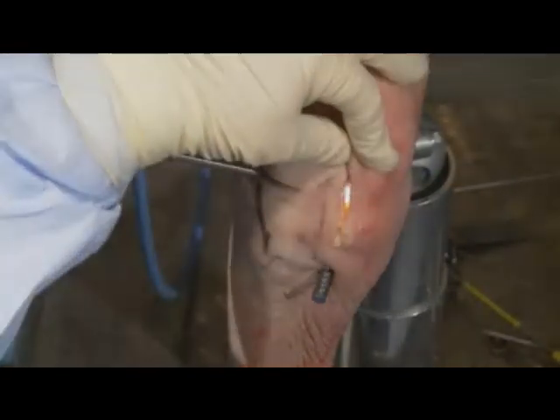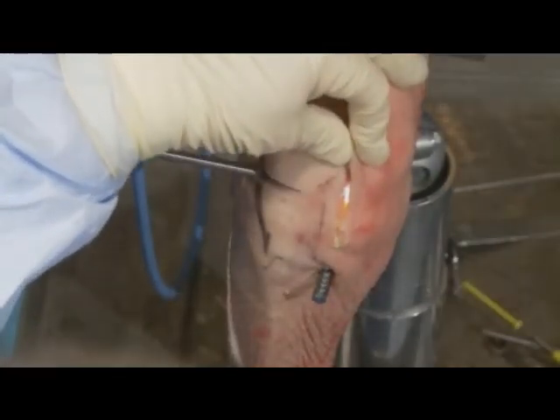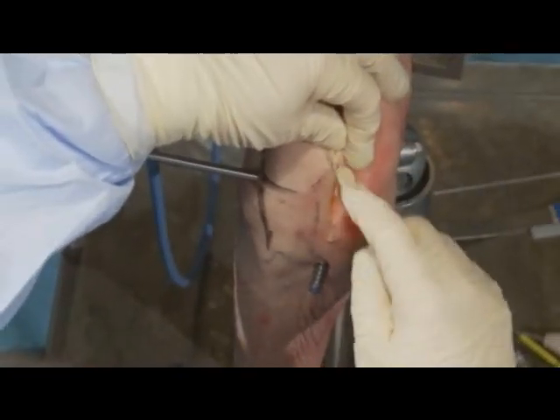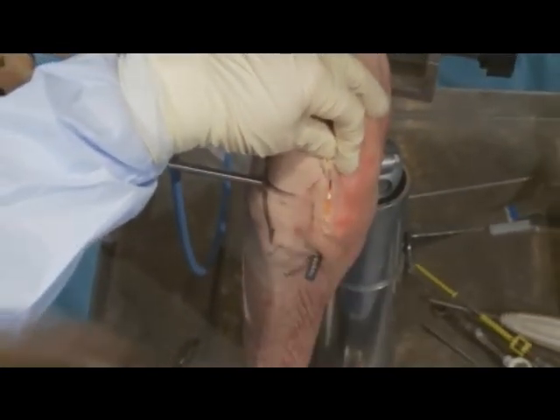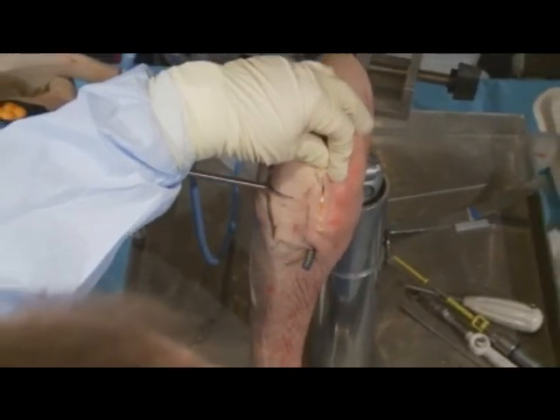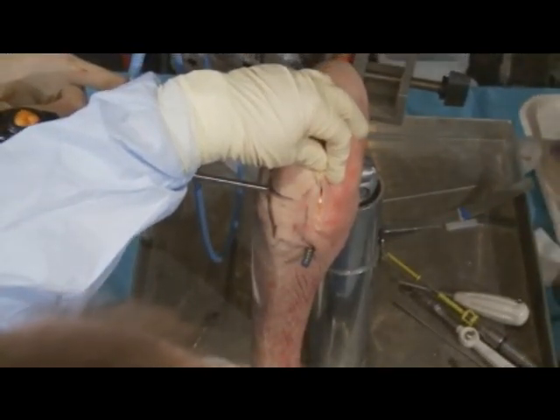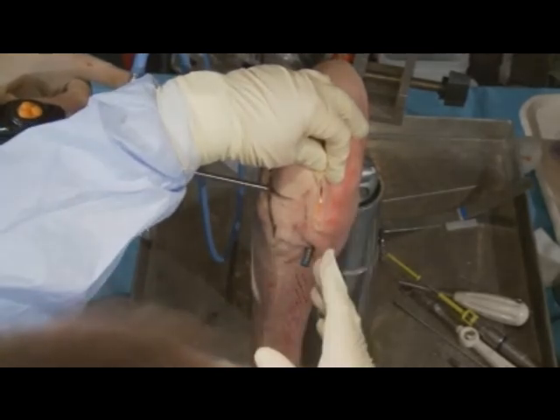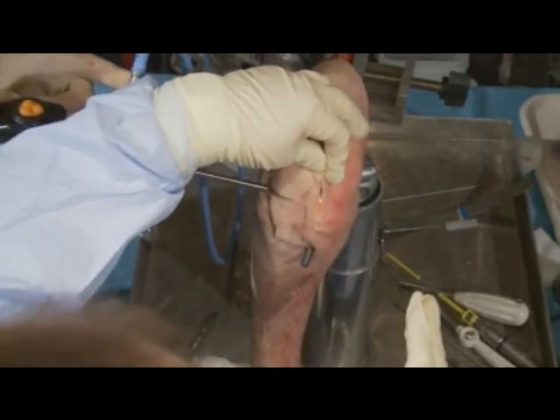So I just want to show you an incision for today's purposes. We're making the femoral incision a little bit longer. But normally what I like to do is start at the midpoint of the patella and go to about half to 1 centimeter distal to the joint line, just adjacent to the patellar tendon, so that I usually make that incision. I don't make the arthrotomy to start with.